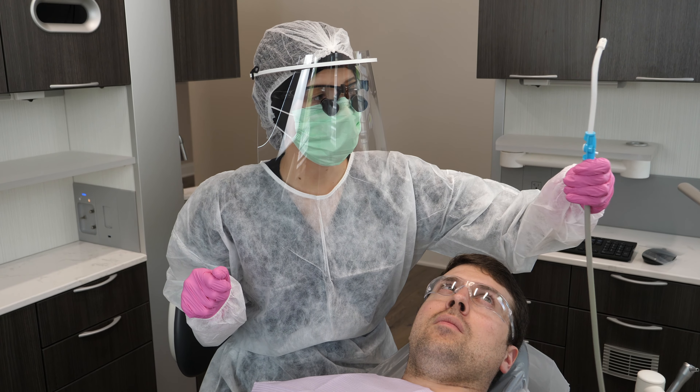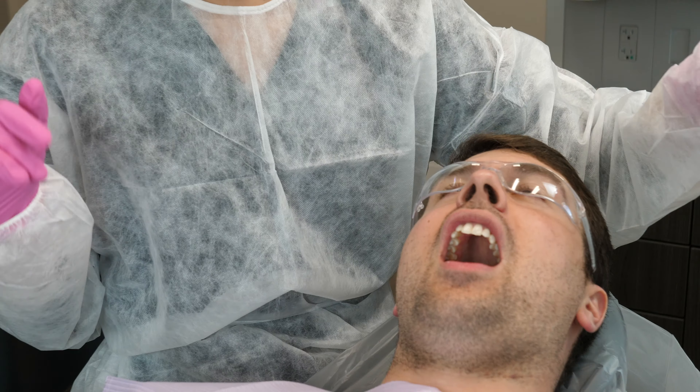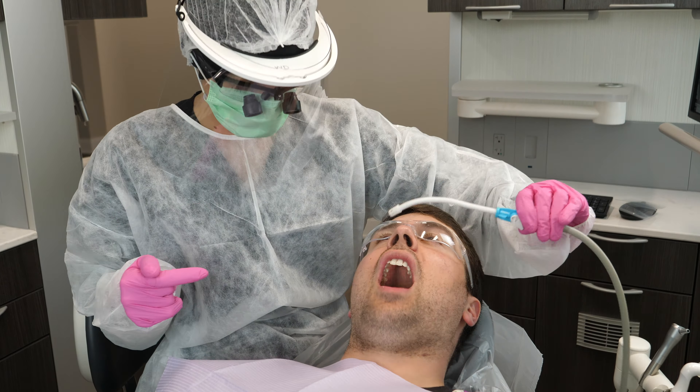Please remember that the saliva ejector does not qualify as a high speed evacuator. Also, your patient should never close on a saliva ejector — don't do that. You have to make sure that there's a backflow protector on it.